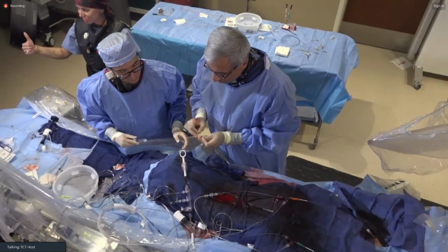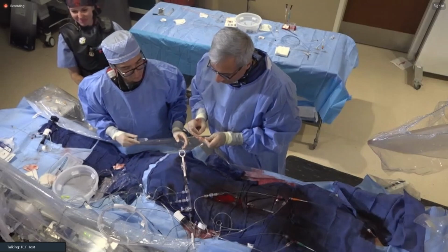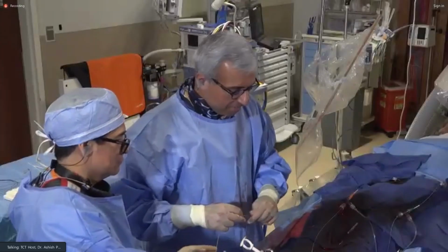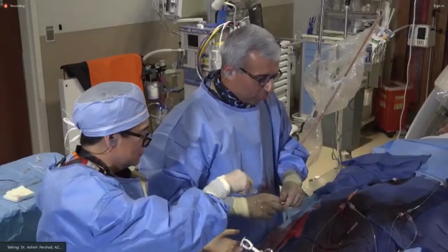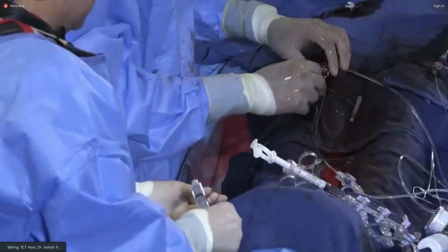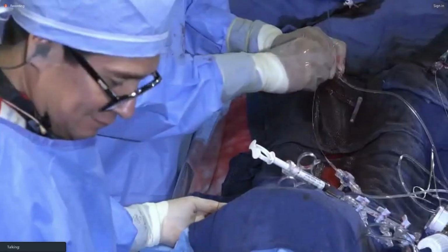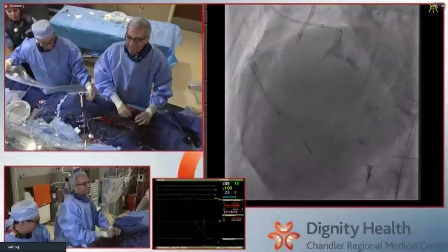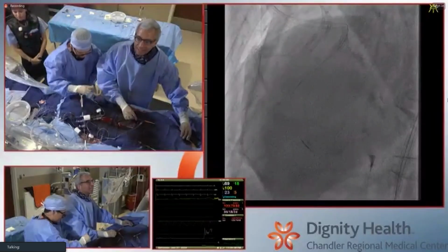As you load that stent onto that really fun externalized wire. We've all been there too. Yeah, which I'm struggling with in the middle of the night here. I got it. We all suffer there. It gets worse with age, Sanjog. Wait and watch. That's funny.